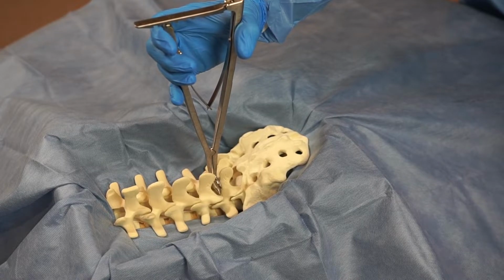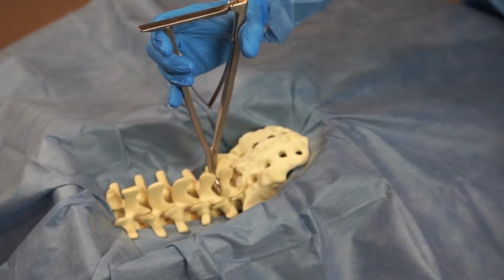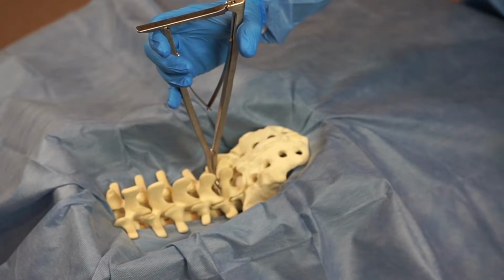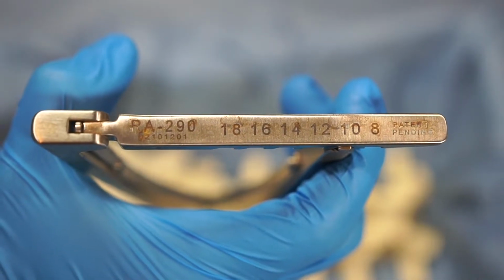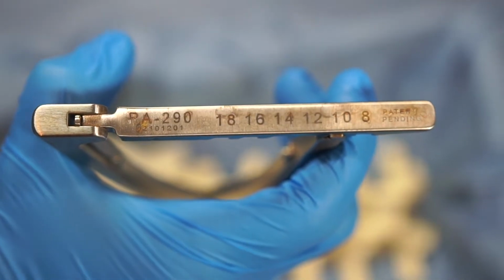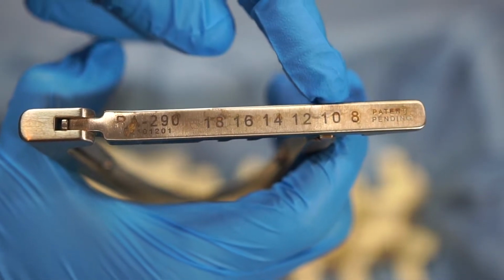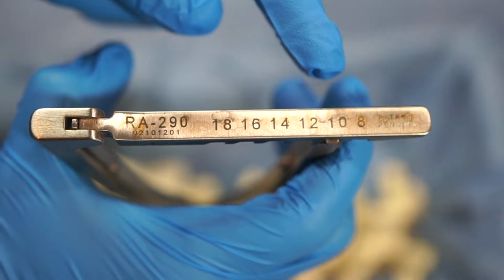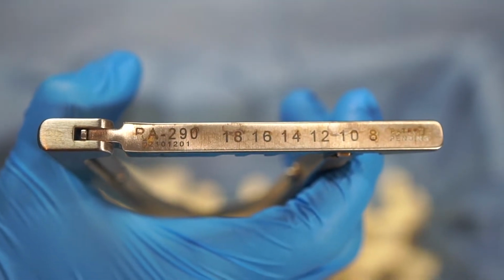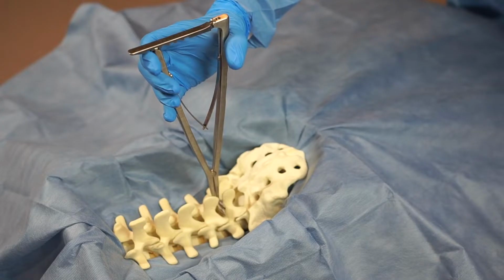Using tactile feedback with the ratchet arm in the down position, determine the implant size. Choose the appropriate Stabilink implant size to best match the bony anatomy, with the ultimate goal of placing the implant as far anterior as possible. Do not overdilate the interspinous space. Excessive force may lead to fractures of the spinous processes.